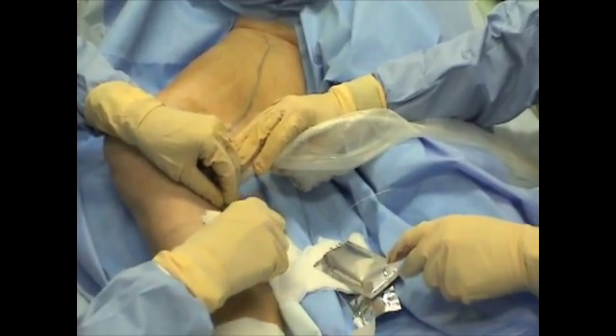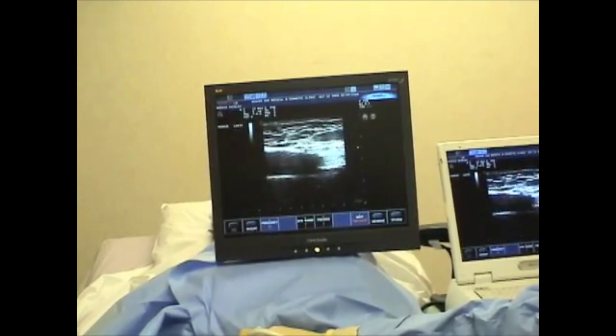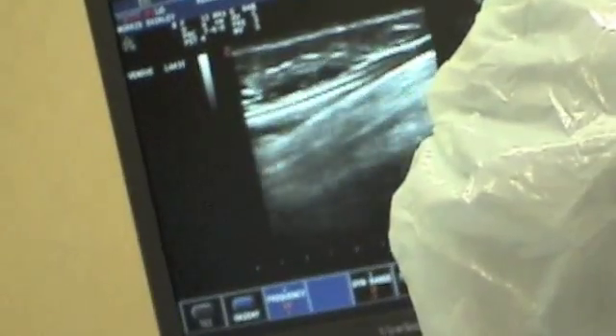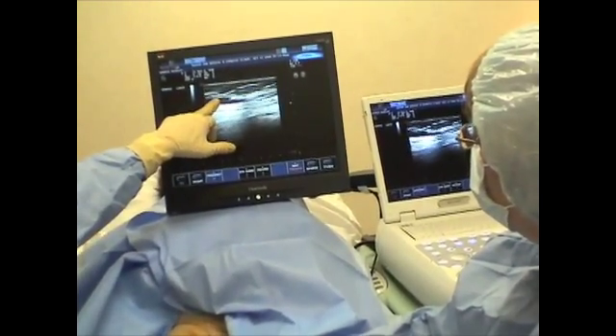A laser fiber is inserted into the cannula and the vein is laser ablated. The prepared solution is used for anesthetizing the area to be treated.